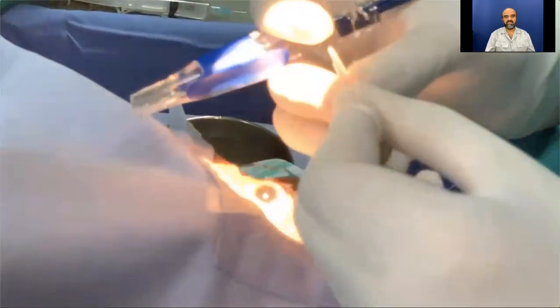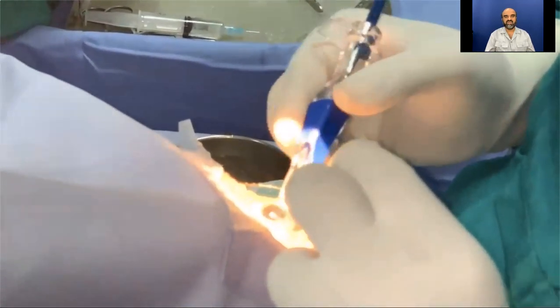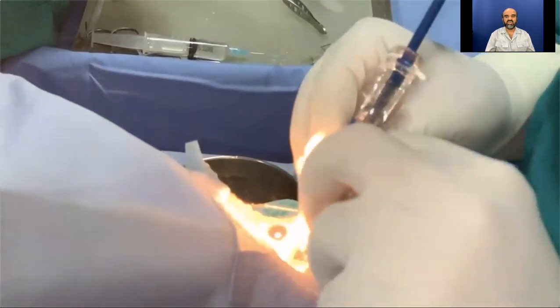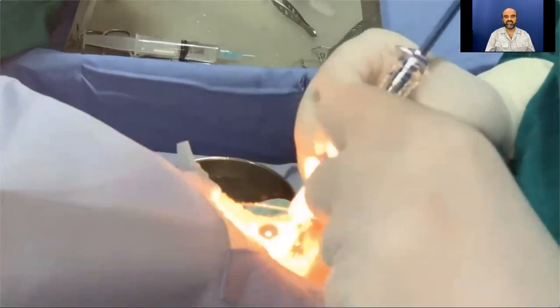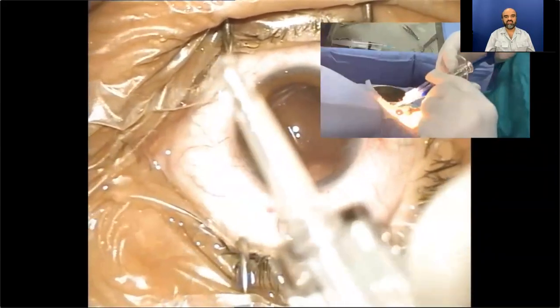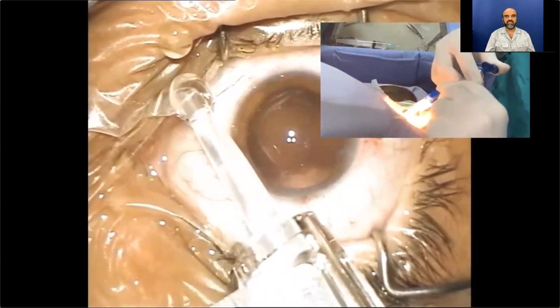The cartridge is parked in the plunger. Interestingly, this beautifully designed injector lacks one feature — locking of the cartridge. Once the assembly is complete, the plunger is moved forward so that the lens is placed in the pre-delivery position.